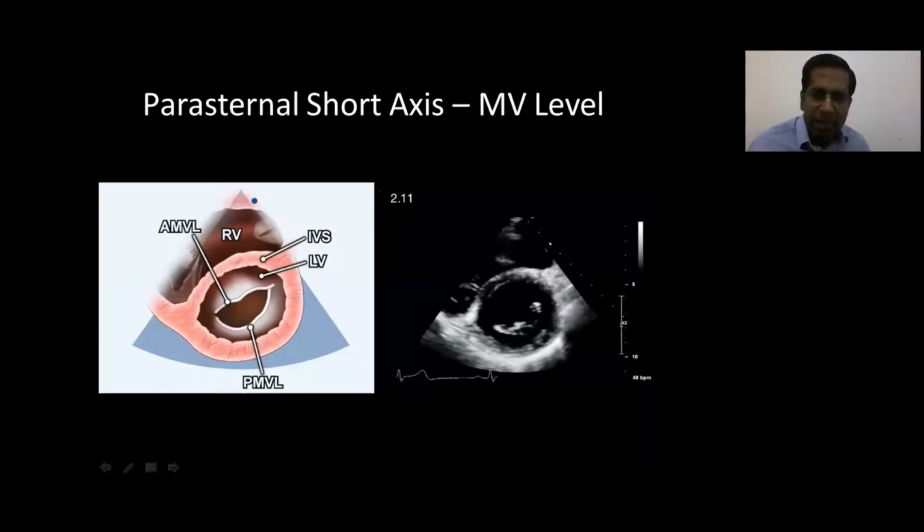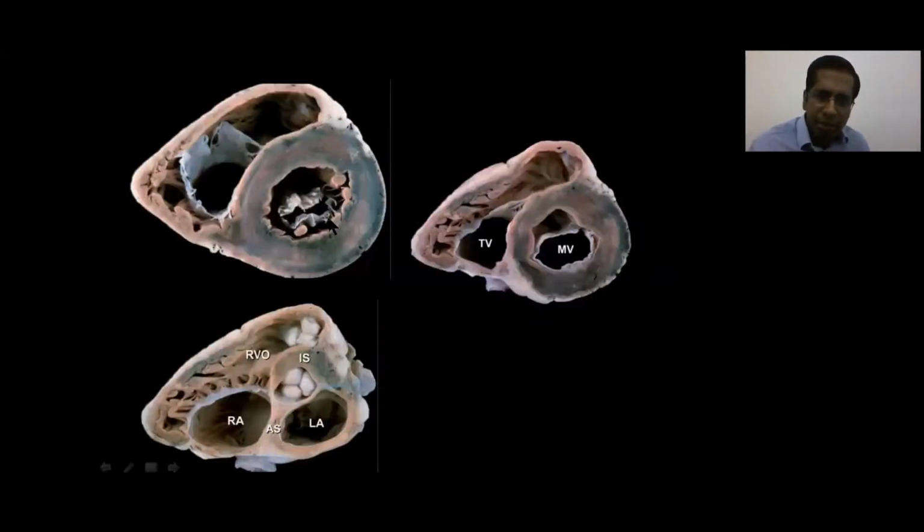It is important to recognize that as you are going from the ventricular aspect towards the aortic valve, that is from inferior, from below upwards. So you are seeing the mitral valve apparatus, you are seeing the mitral valve, and what you are seeing here is the LVOT.